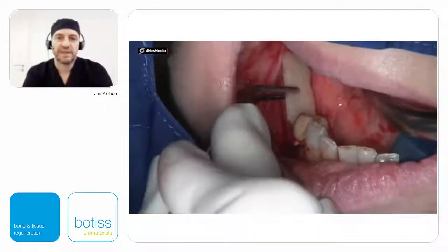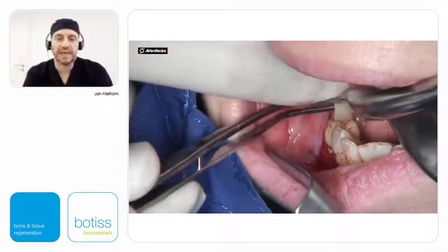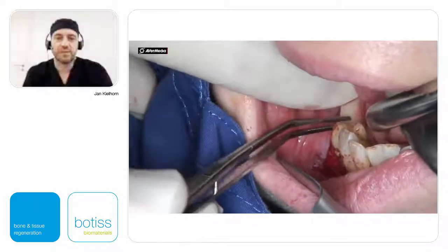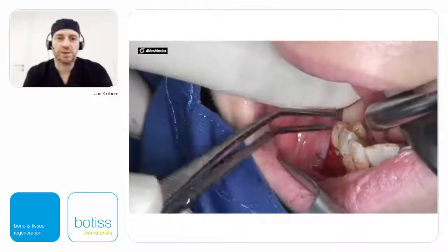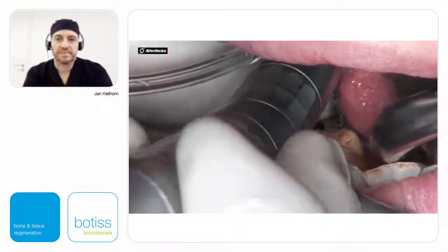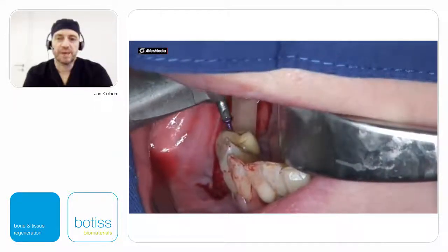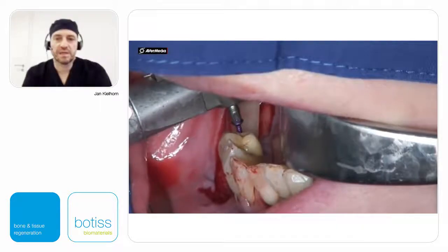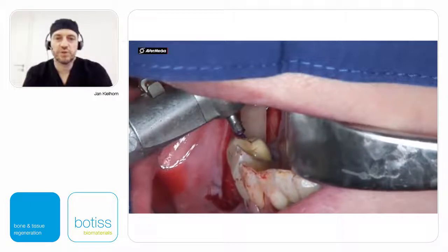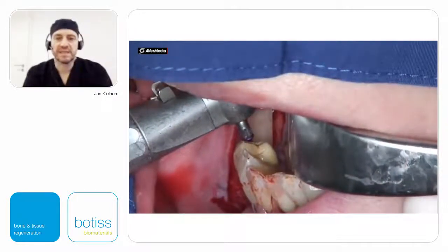So you see here that we will make a trial of the cortical blade in order to decide, it should be like a plank on the ship. We'll see how wide and how long it should be. Then we drill for the holes on the outside. Fix that using osteosynthesis screws vertically. First one screw, fix the blade, then drill the second hole, and then the second screw.